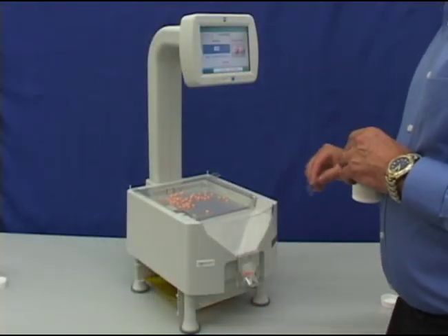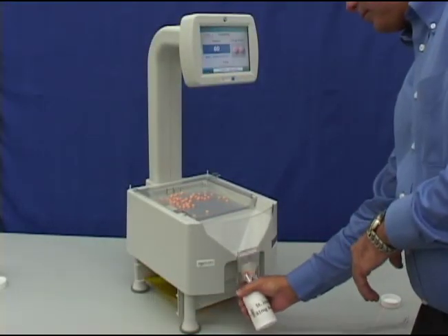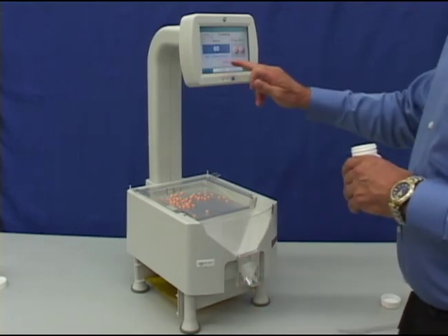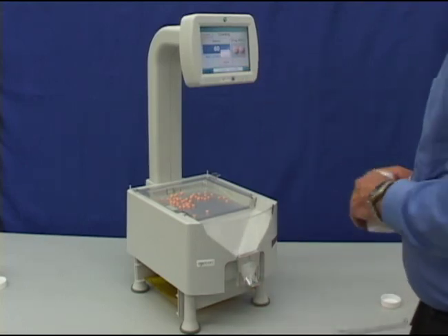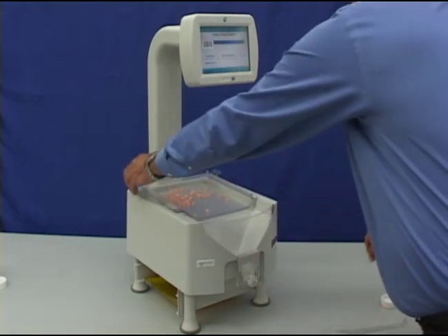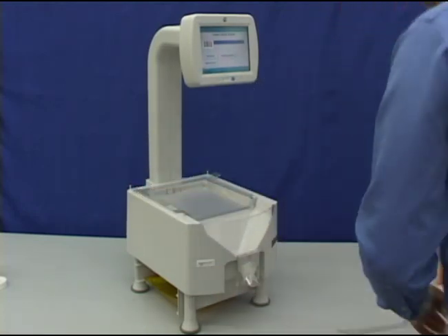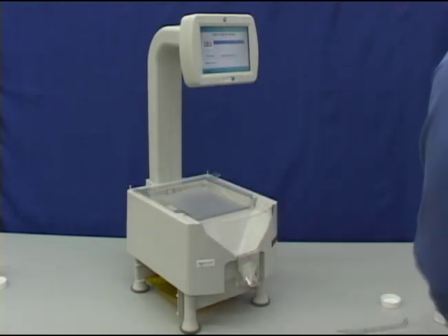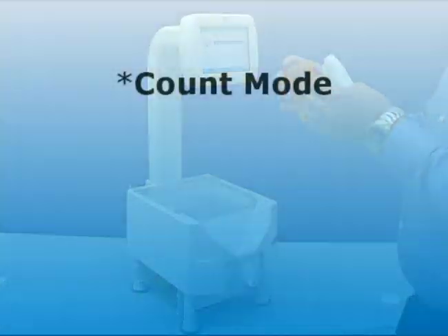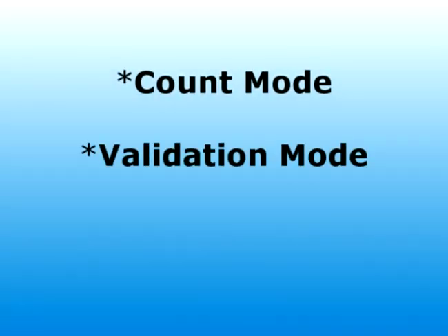Remove any excess pills from the platter and return them to the stock bottle. Press Finished on the screen, tip the platter, and dispense the pills into the prescription vial. And that's all there is to it. The next mode of operation is the validation mode.